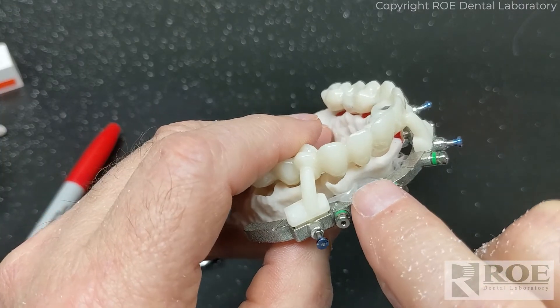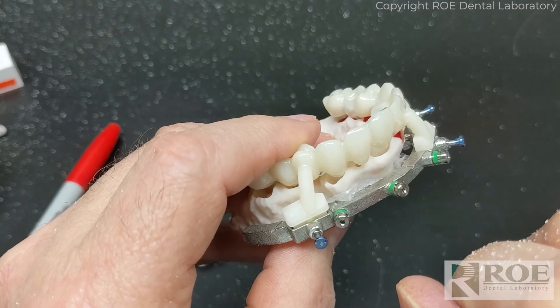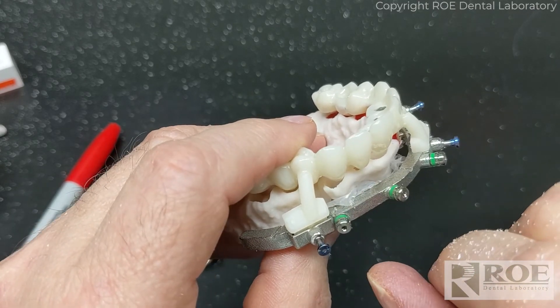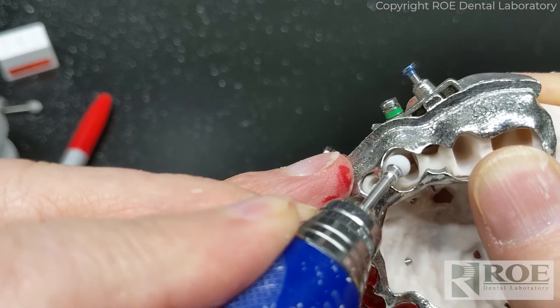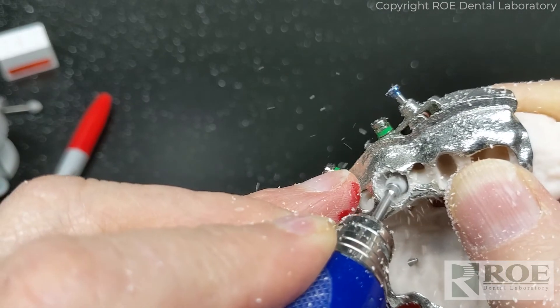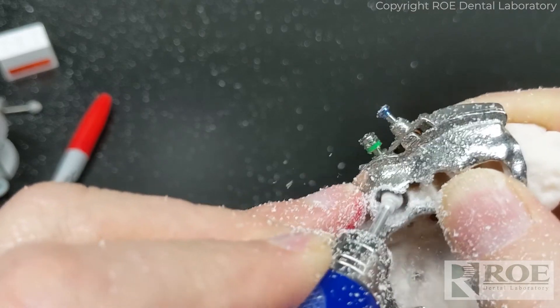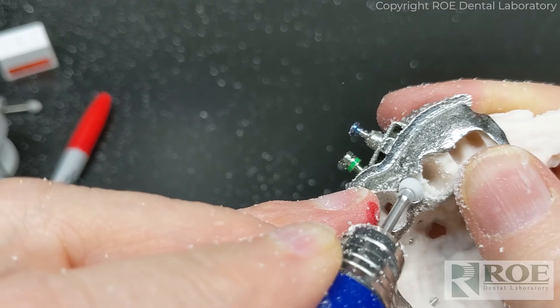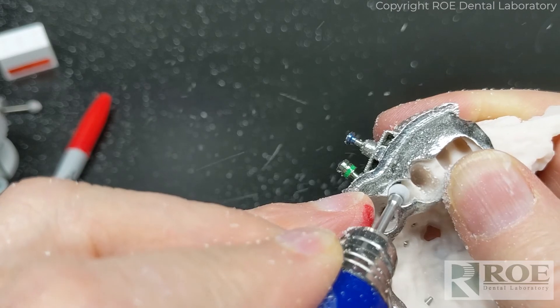I think the area we're looking at is right here on the mesial gingival area of the canine, so I'm going to relieve this area and see if that's where we're hanging up. I'm relieving the bone in the canine — the number 11 area — taking away the bone I think is interfering with seating that tooth. It's usually towards the gingival. I'm also going to go to the next area, which is a pontic, and create my ovate site for the pontic itself.